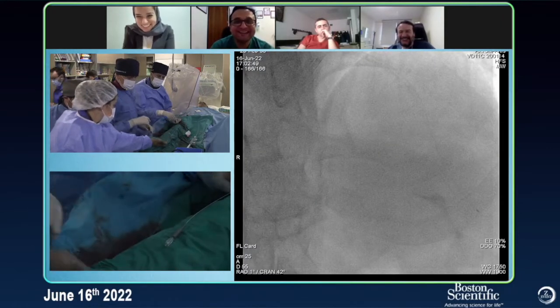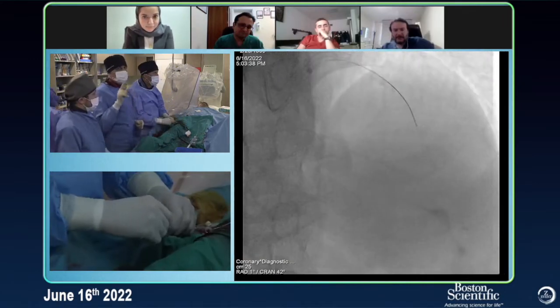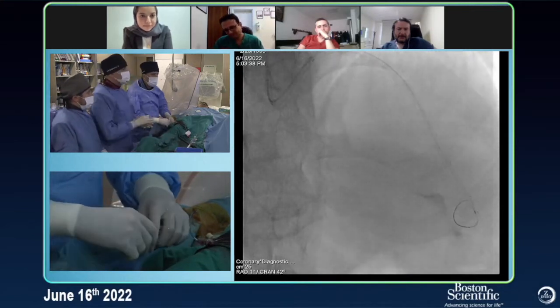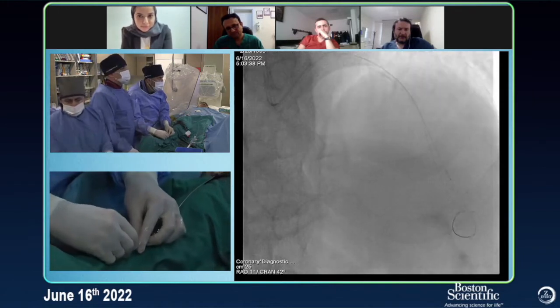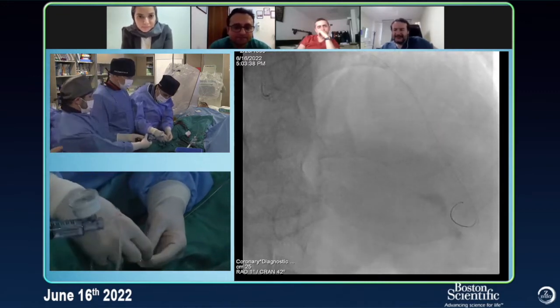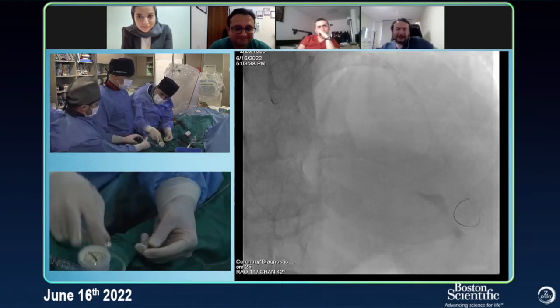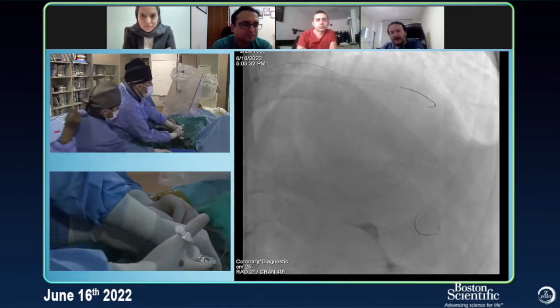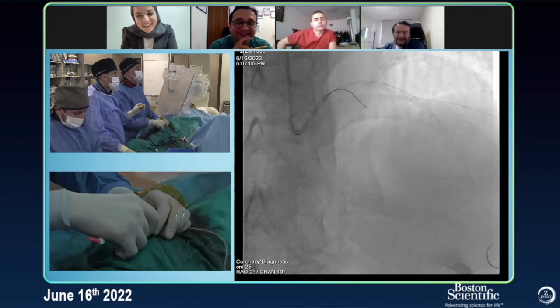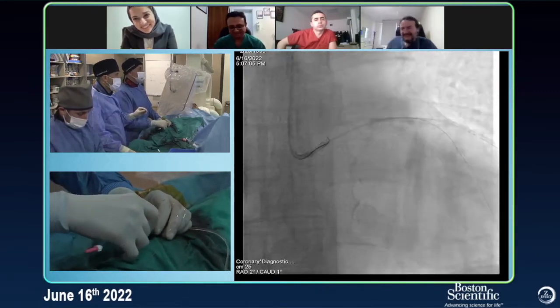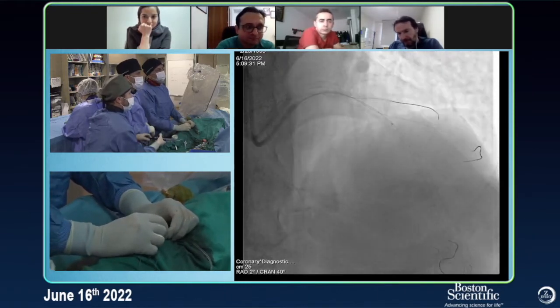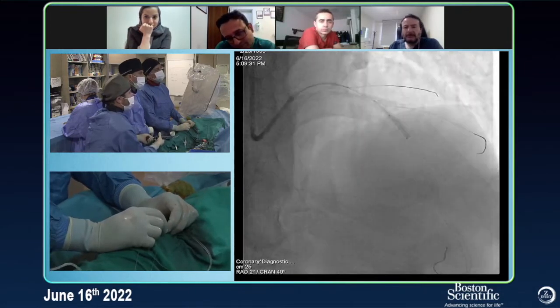Before dilatation, I like to insert a wire to the big diagonal, because after dilatation I might have a dissection and it will not be easy to get into this big diagonal. What do you think? I think it's time to wire it — I would protect it. It will be very exciting to see you wire that diagonal. If I couldn't open it, then I'll try a cutting balloon maybe. I agree, but now let's try it and see.